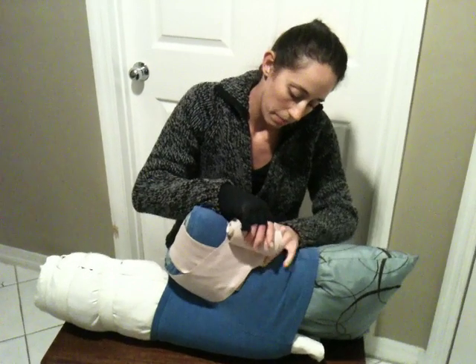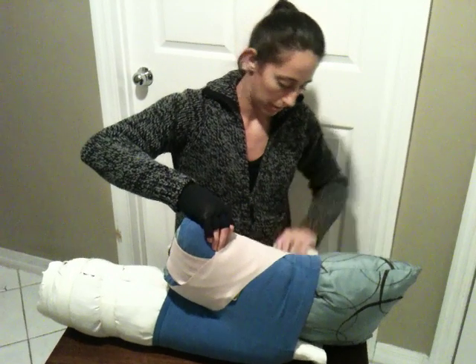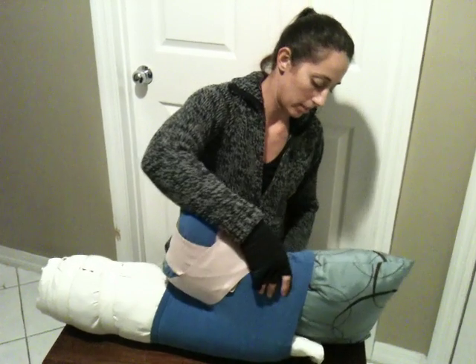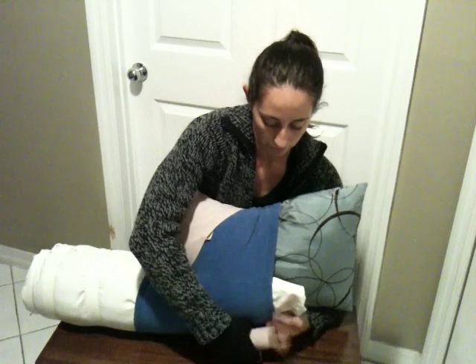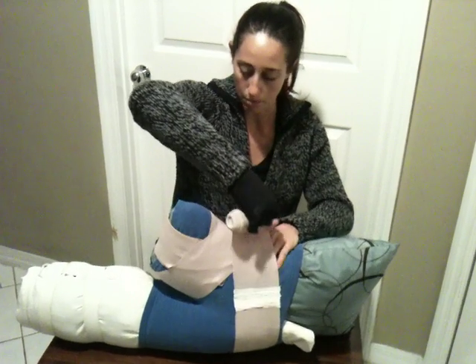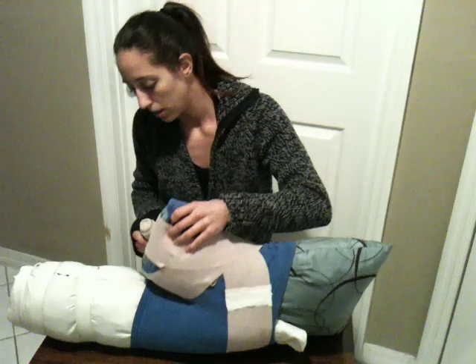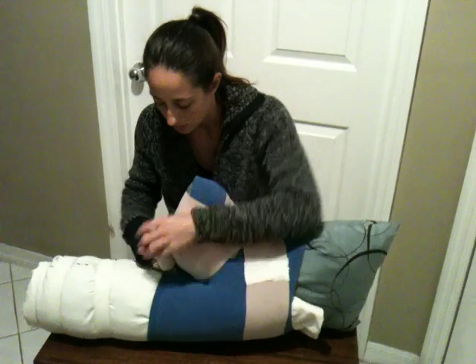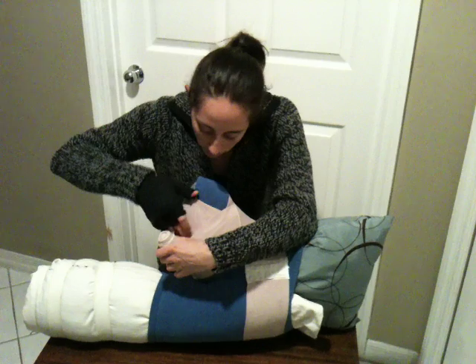The tension for these wraps is supposed to be tighter distally and gradually decrease. Here's going to be our hip anchor — I'm going to come across the hip and then angle it back down and try to cover the exposed areas. I want to make sure there's no folding.